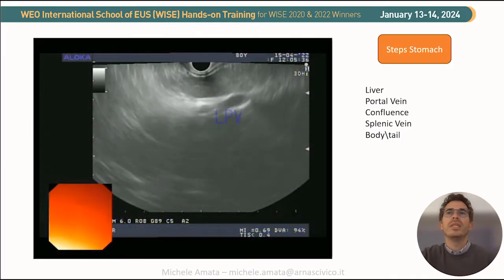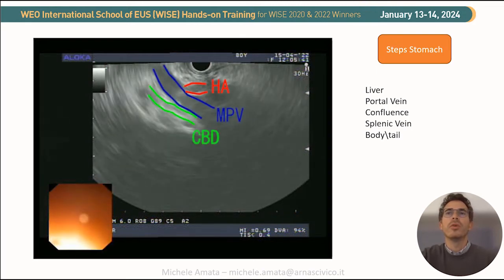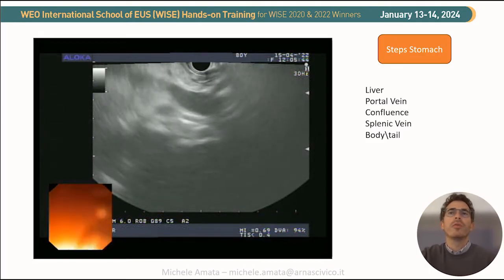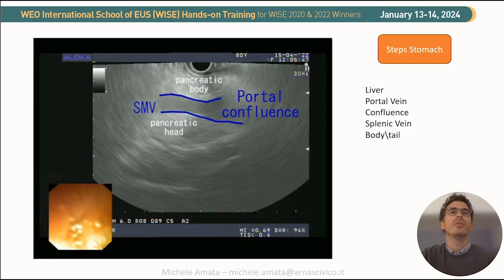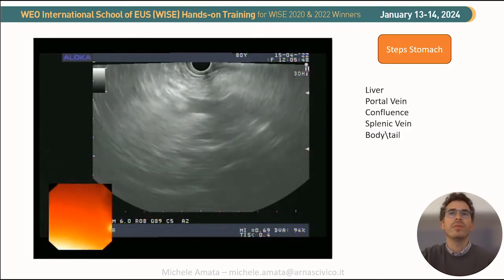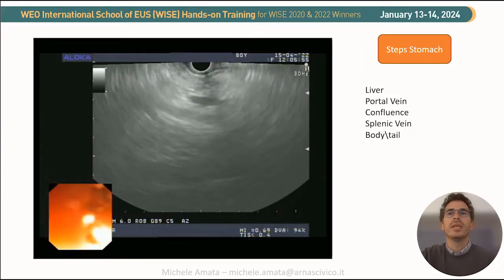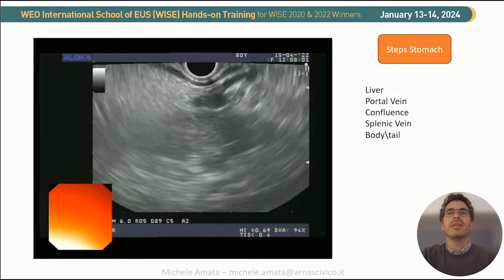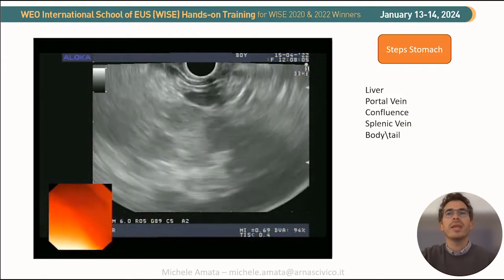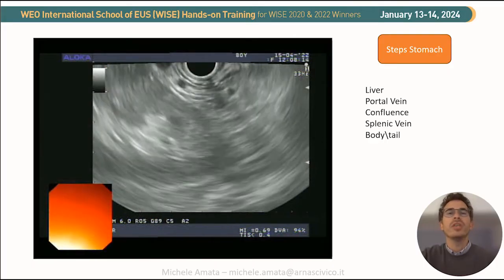We see the left lobe with segments 2 and 3, and following the left portal vein by moving clockwise, pushing the scope, and moving down the big wheel, we arrive at the hepatic hilum. With clockwise and counterclockwise movements, we arrive at the portal confluence and the pancreatic parenchyma comes into view. On the left we see the superior mesenteric vein. Following the splenic vein clockwise, the body and tail are easily detected. Continuing clockwise, we cross the kidney and left adrenal gland, then with soft back-and-forth movements and withdrawal, we arrive at our lesion in the para-aortic space.